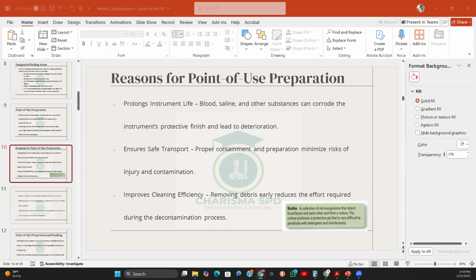If it is reduced, the dirty instrument is easier to what? Carried. And because the weight is reduced, there's no likelihood of what? Any injuries. The cart or the transportation is not heavy any longer. And once it gets to the decontamination area, because the soil, the fats, the bone chips, and the tissues have been removed, it's easier to clean and easier to reprocess.